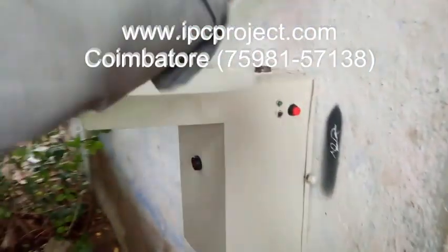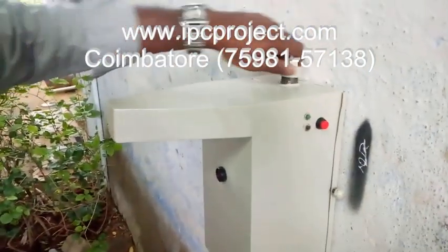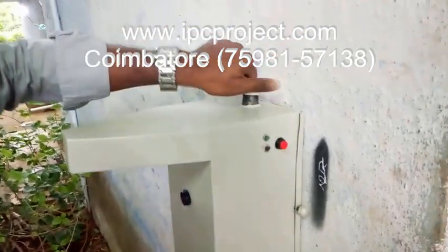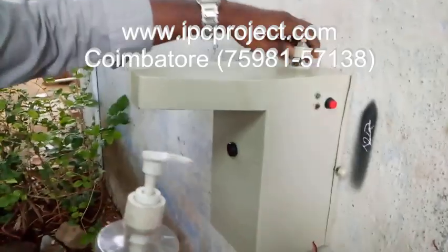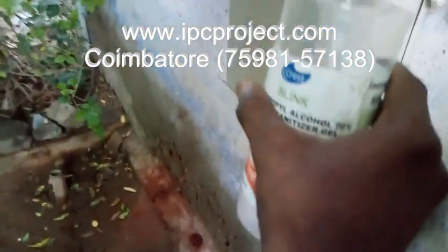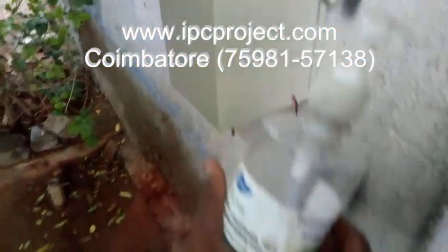This is the pouring mechanism for sanitizer. You have to open that one, pour the sanitizer in, and it will close. 1-liter is the pouring capacity. You have to pour the sanitizer in here. After that, you have to close it. This is the sanitizer compartment — 1-liter capacity.